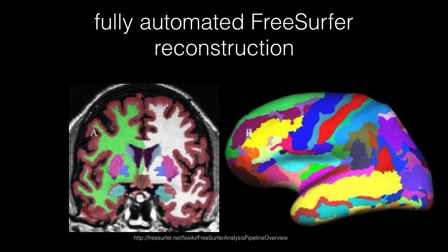those manual and semi-automated voxel labeling techniques have mostly been replaced by fully automated whole brain labeling techniques like FreeSurfer. Whole brain labeling works by starting with a template brain, which you might also call an atlas. That atlas has pre-labeled voxels for the anatomical structures of interest. Software like FreeSurfer takes that atlas and its component anatomy and moves and rotates and stretches everything into alignment with your T1 image of interest. That's called nonlinear spatial registration.